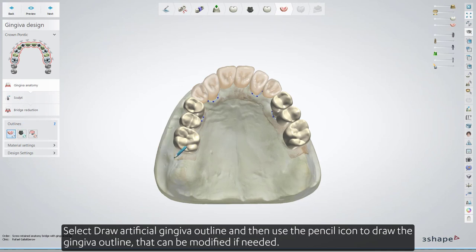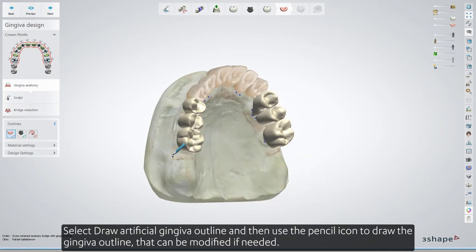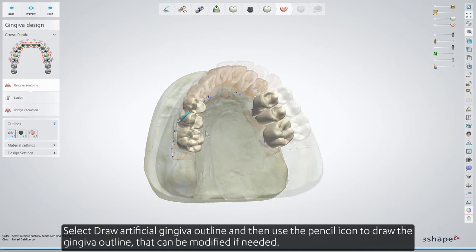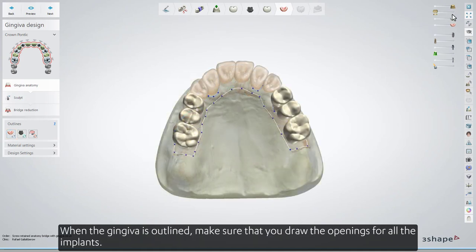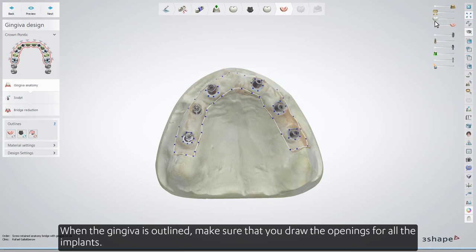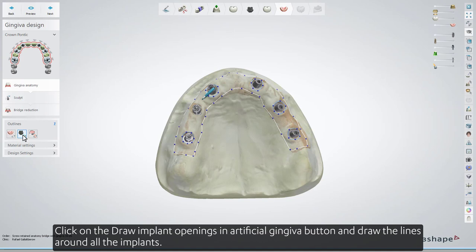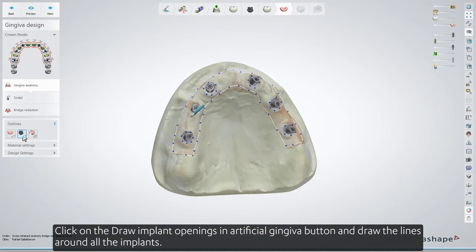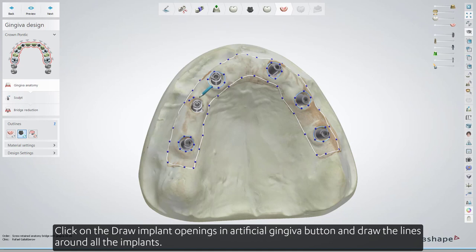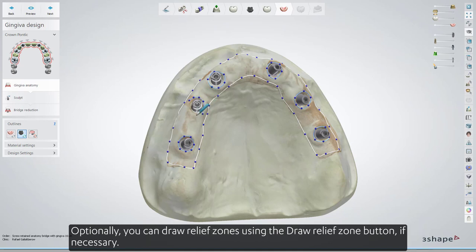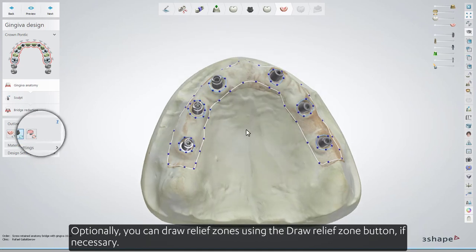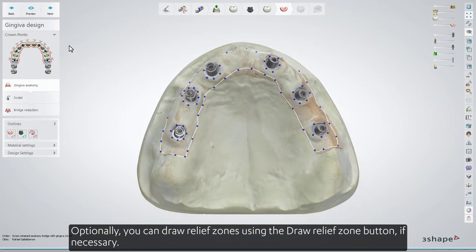Select Draw Artificial Gingiva Outline, and then use the pencil icon to draw the gingiva outline, which can be modified if needed. When the gingiva is outlined, make sure that you draw the openings for all of the implants — it's important because those openings are needed for ensuring that the implants go well inside the gingiva. Click on the Draw Implant Openings in Artificial Gingiva button and draw the lines around all the implants. Optionally, you can draw relief zones using the Draw Relief Zone button if necessary.